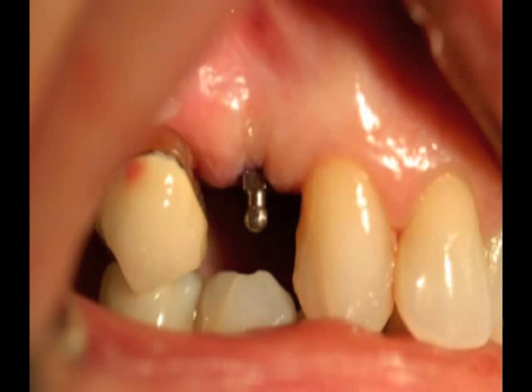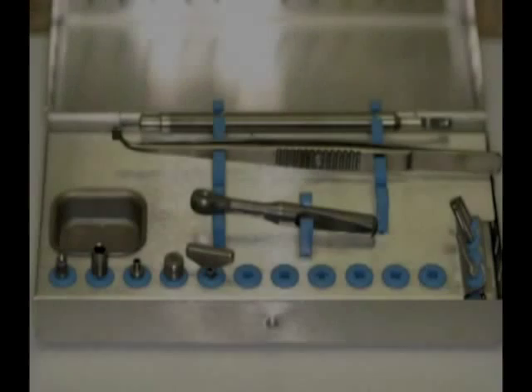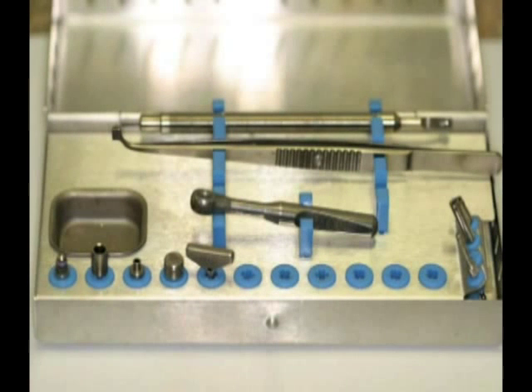I hope that you adopt this protocol for your office and enjoy sharing the benefits with your patients. You can see here we have laid out all the pieces and parts that we're going to use in today's surgery. The most important elements are the surgical kit, the spiral drill, and all the housings and ancillary items.